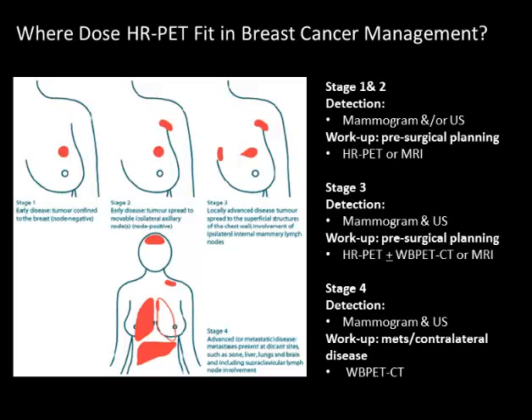Dr. Keeper showed you what he found with the breast-specific gamma imaging. But I think nuclear imaging is not going to be as impacted by waiting for architectural change. It's going to look at the cell itself, the cancer cells themselves.